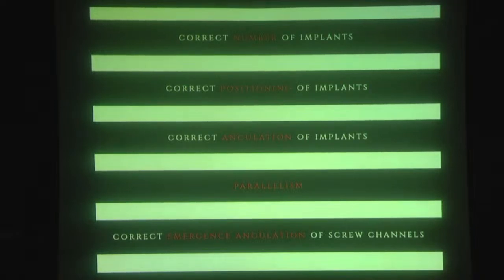No, only two minutes. We have some important criteria, which is a correct number of implants. The second one, correct positioning of implants. The third one, correct angulation of implants, parallelism, and correct emergence angulation of screw channels. And I had a conversation with my colleague, and she was asking me about the parallelism and the correct angulation of implants, correct emergence angulation of screw channels. And I answered, it depends. It depends on the case.